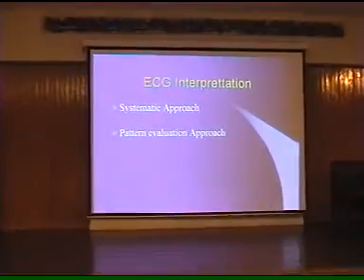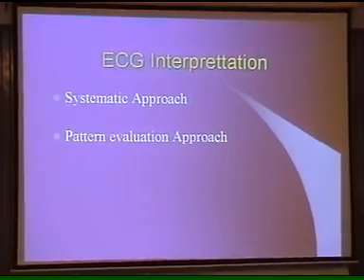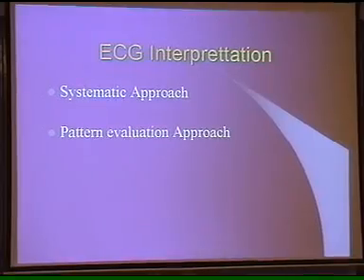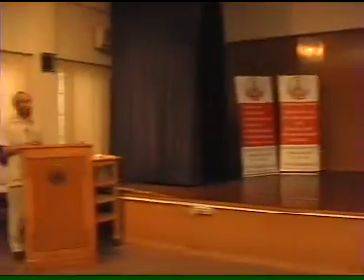There are basically two approaches to interpreting the ECG. We can either make a scientific analysis of the tracings on the principles of electrical conductivity. That's time consuming and a little difficult, but that is the more appropriate and exact approach.